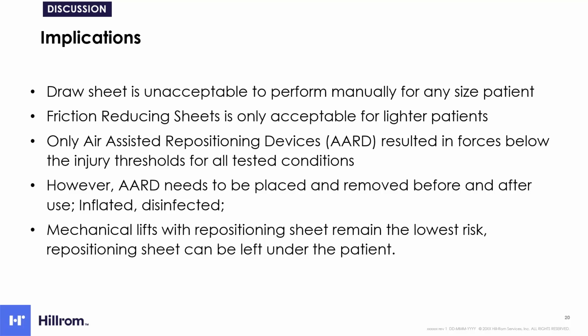The friction reducing sheets are only acceptable for lighter patients. Only the AARD, or the air-assisted repositioning devices, resulted in forces below the injury threshold for all the conditions. However, the AARD needs to be placed under the patient before use and removed after use. Also, it needs to be inflated and disinfected. So mechanical lifts with repositioning sheets probably remain the lowest risk, and the repositioning sheets can be left under the patient.